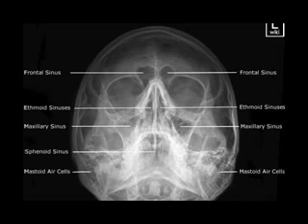The superior wall of the maxillary antrum is denoted by two parallel lines equidistant on both sides, the superior line of which is the inferior rim of the orbit and the lower line is the floor of the orbit a few millimeters behind. When there is a blowout fracture of the inferior orbital wall, these two lines on one side are telescoped compared to the other, and this is suggestive of a blowout fracture of the inferior orbital wall.